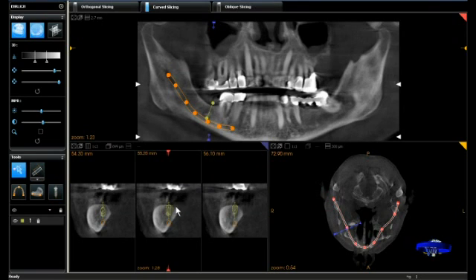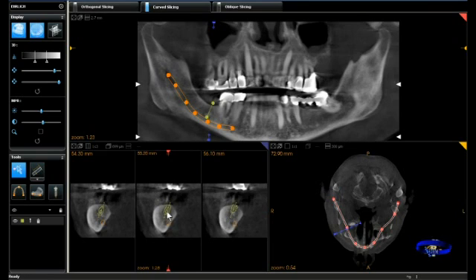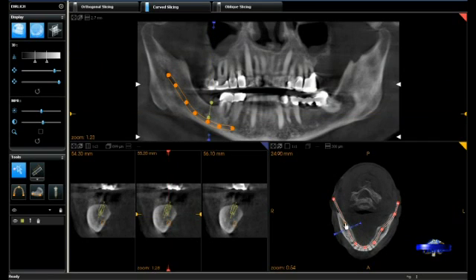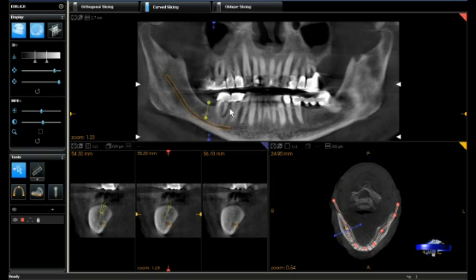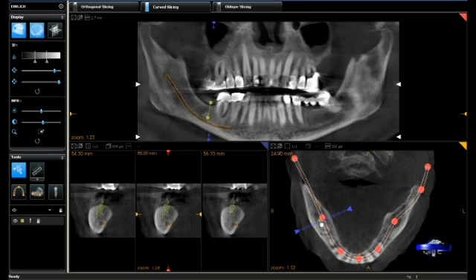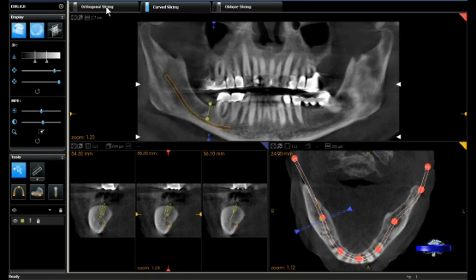Once the nerve canal is marked, we can go to the implant library and choose an approach. At this point we can angle the implant fixture and refine the positioning in the axial, panoramic, and cross-sectional views. We can now see the implant and make final corrections. In the axial view we can also see a periapical radiolucency on that molar — we should take note of that — and we'll make our final adjustment to move it to the middle of the bone.